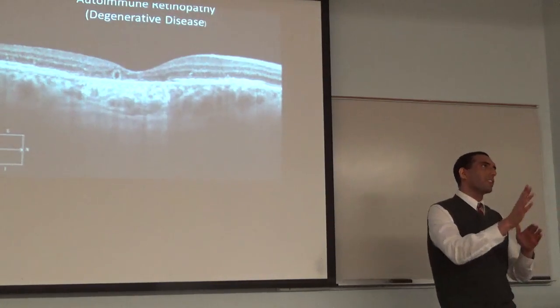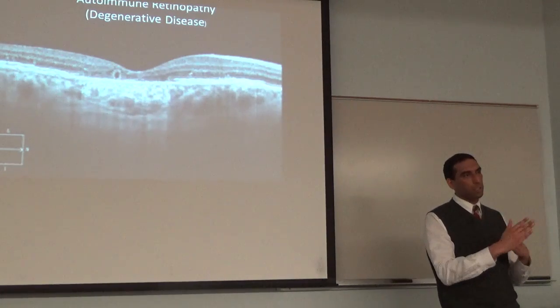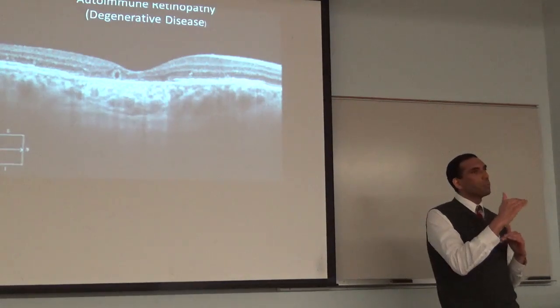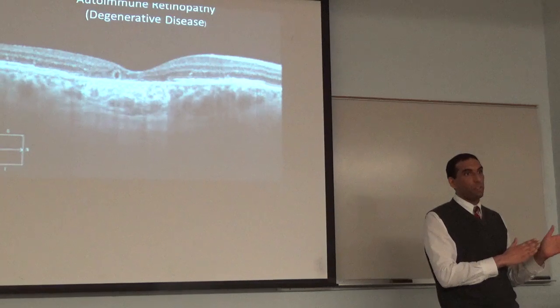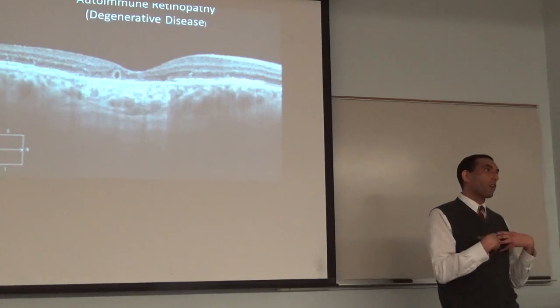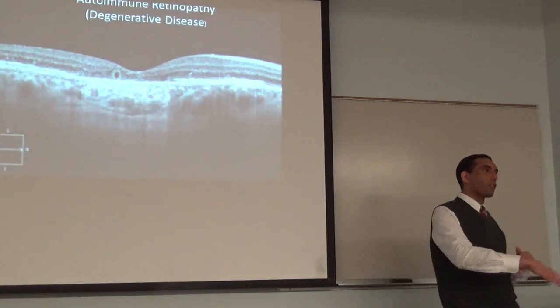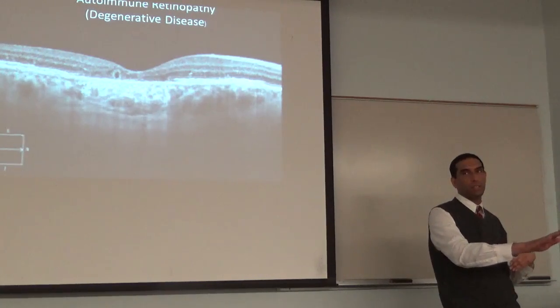In terms of other challenges, outside of ophthalmology too, obviously that's not my expertise, the 1 millimeter depth is the biggest restriction. The other area where this is being used heavily is in cardiology, where they're trying to image coronary arteries with this technology. Coronary arteries are very small, and you can thread catheters into them. That's how a lot of heart attacks are treated these days.